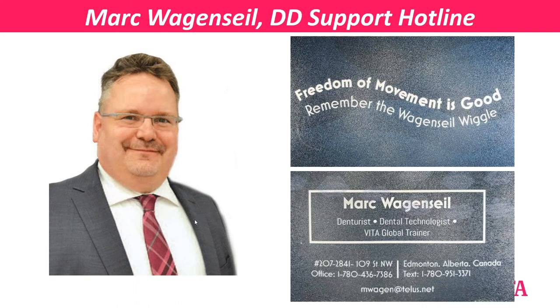So coming back and tying it together, a check bite, yes. The more you change, the more the central nervous system has a hard time adapting to those changes and can give you a false reading. Yes. And you want to check it by not using the word bite. You want to use the word swallow. Because then if the patient swallows and you see that bite drift back, then you know you need to take a check bite. Swallowing will always, again, remember, it's a subconscious effort. Subconscious command. You're tapping into the subconscious of the central nervous system.